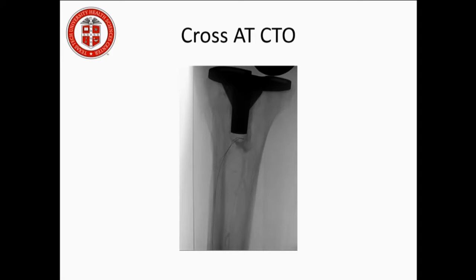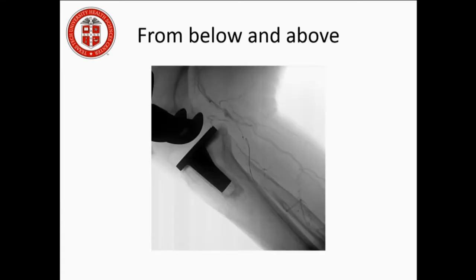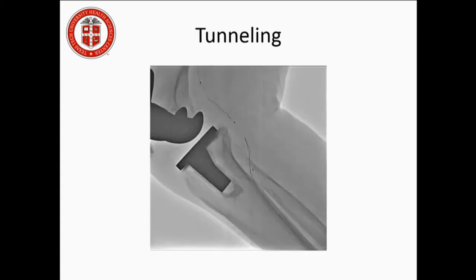We cross the anterior tibial CTO from below — as you can see, he has a knee implant — and now we're entering the popliteal from below. We're going from below via the retrograde access as well as the antegrade axis, and here we have tunneling. You can see the knee is folded because of the knee implant.